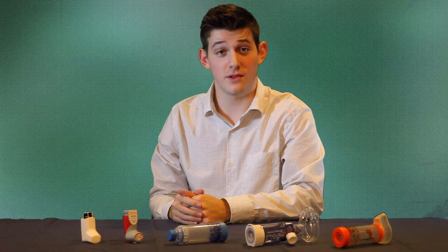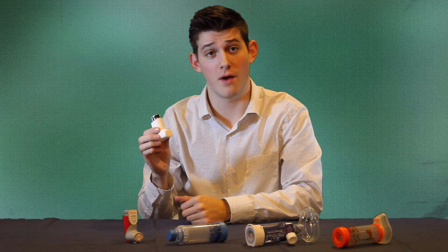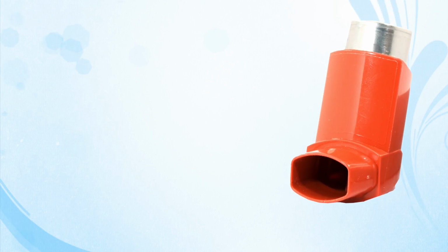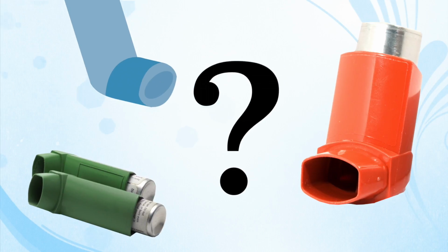Today, you are going to learn how to teach children with asthma how to use their metered dose inhaler, or MDI, and spacer. MDIs have been shown to be the most commonly prescribed device to treat breathing problems, yet they are the most difficult to learn how to use.